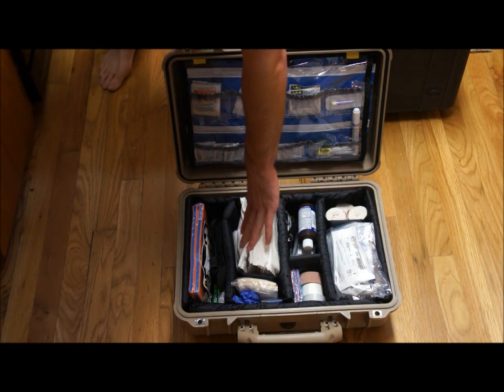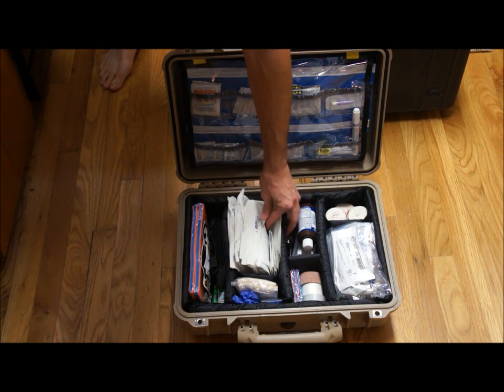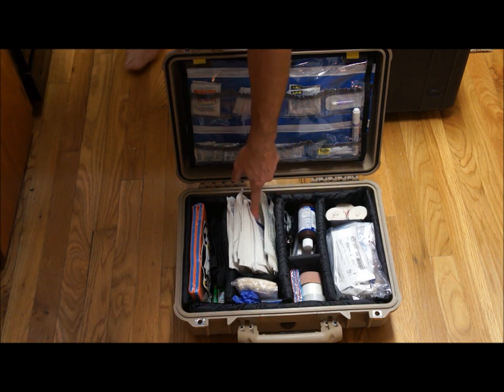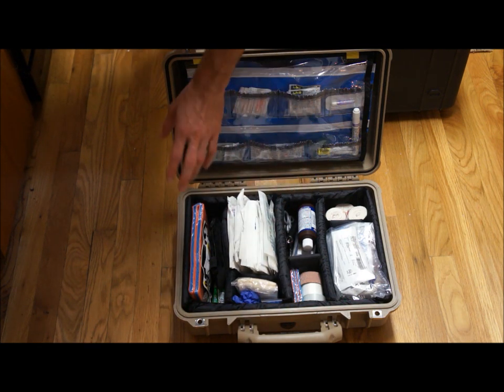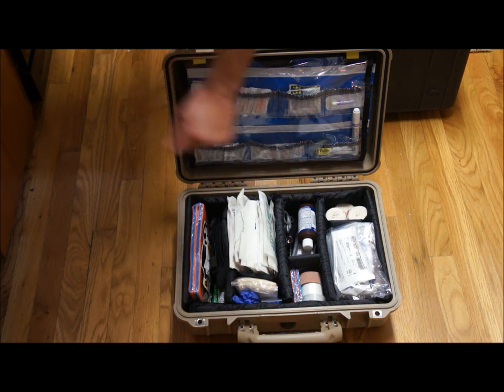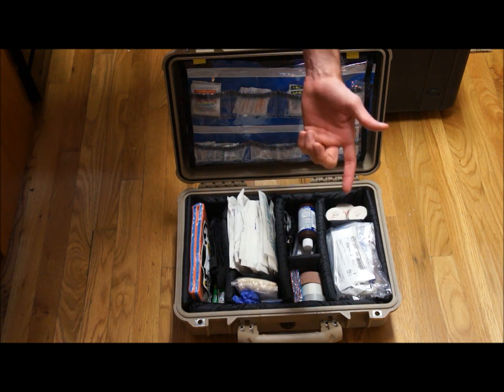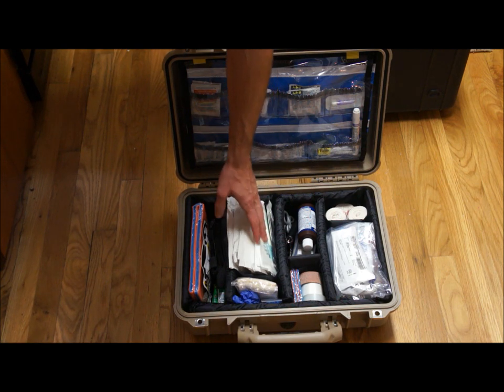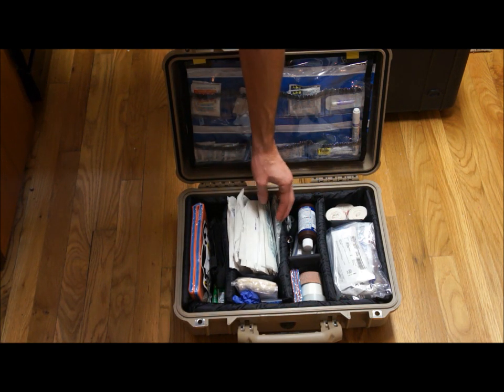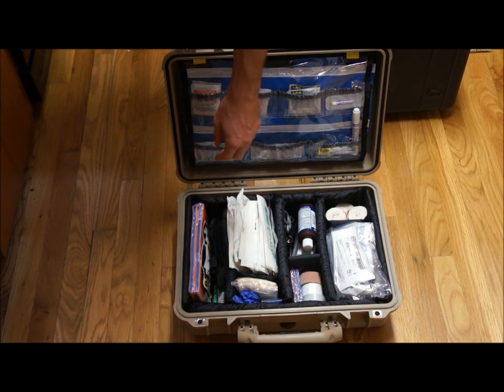These are all gauze pads. I've got some Tegaderm, some Telfa pads — Telfa pads are non-adherent dressings, so you'd apply that first and then apply the gauze. Because once your blood dries and you rip the gauze off, you just ripped off the clot — so it's going to start bleeding again and it's going to hurt like hell. Apply the Telfa pad first. I've also got some Xeroform, which is good for burns and things like that.